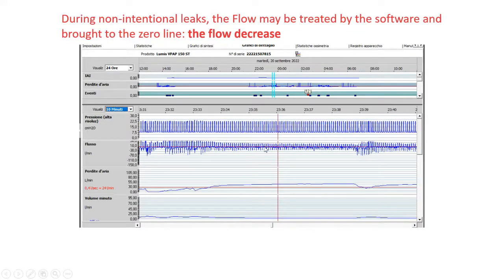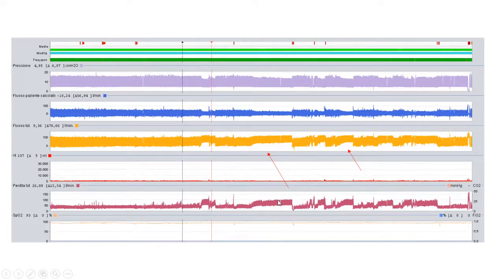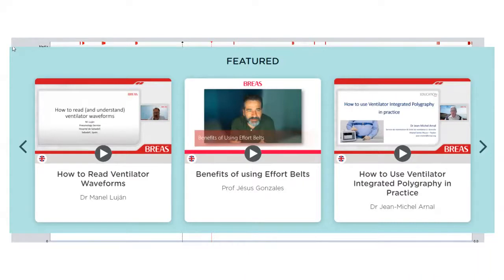As you can see, when non-intentional leaks increase, the software shows a decrease in flow — different from what I described before — because this flow is treated. Breas, for example, offers two different flows: a total flow similar to what a sensor detects between the tube and the patient, and a patient flow. When leaks increase, you see an increase in total flow as expected, but the treated patient flow shows a decrease.